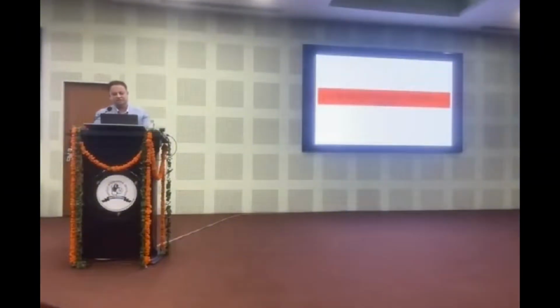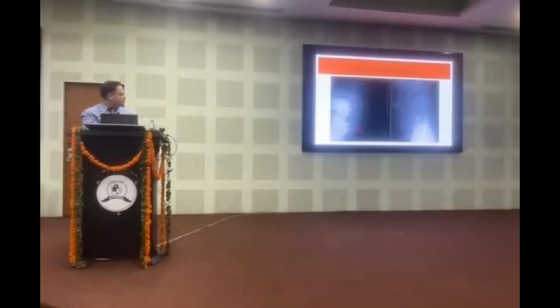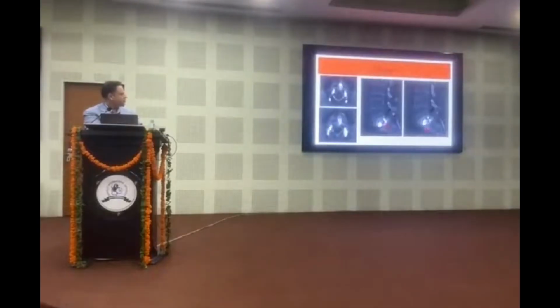So enough of the fancy stuff, but will this fuse eventually? This is another question. So another 55-year-old male, back pain, this is the level identified. You can see here the immediate post-op X-ray, a 1-year follow-up, a 2-year follow-up. You can see the bone, well inside, outside, all around, just fused very nicely and well. So this is good enough for 1 level only.